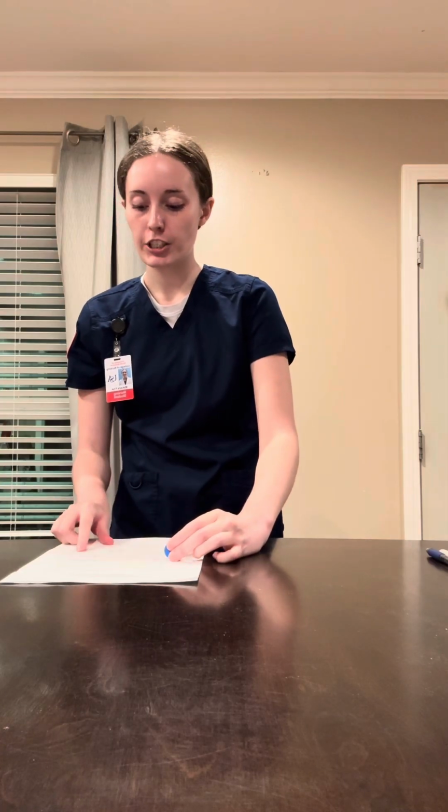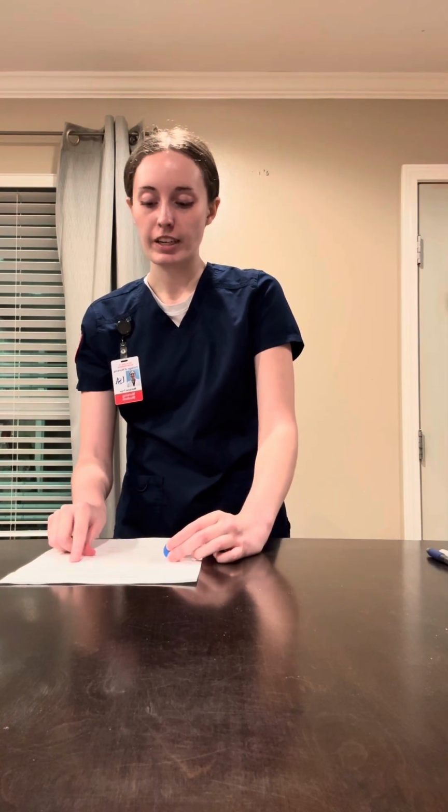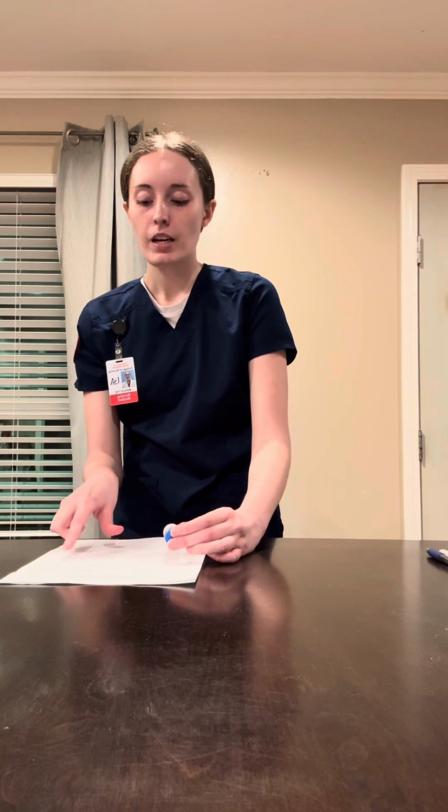So I'm going to set this down right here. Okay, so Jaguar J. Jones, MR is 4176352, allergic to penicillin. All right, so I have heparin, 5,000 units. This is 10,000 units per milliliter, so I would draw up 5,000 units per 0.5 milliliters. Okay, it's given subcutaneously every 12 hours. The patient has not had it in the last 12 hours.